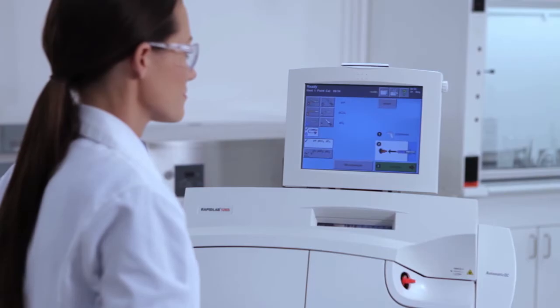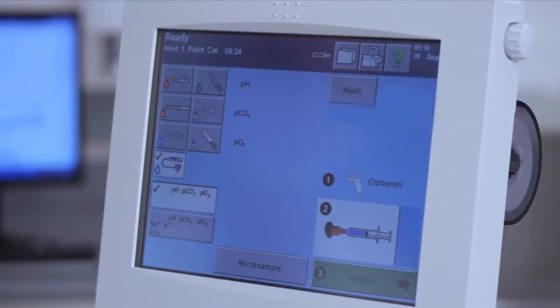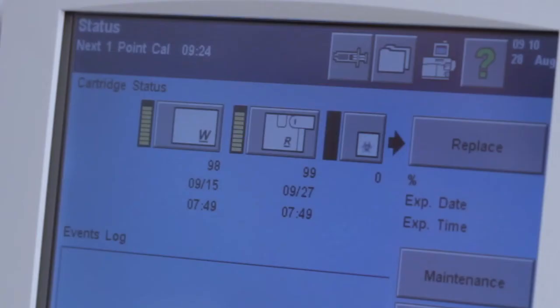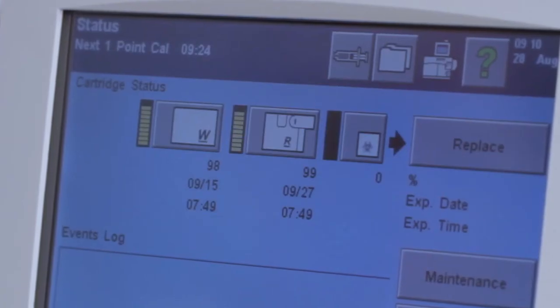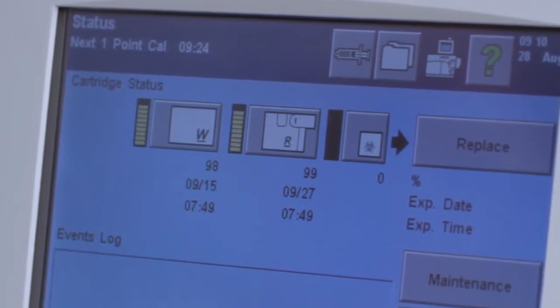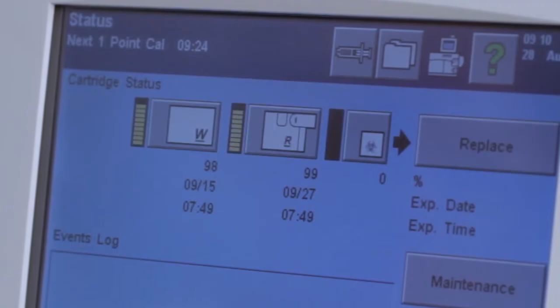To further speed workflow, commonly requested panels may be predefined and readily accessible from the main screen. The banner at the top of the main screen indicates the time to the next calibration, the type of calibration, pending QC routines and other various routine functions.